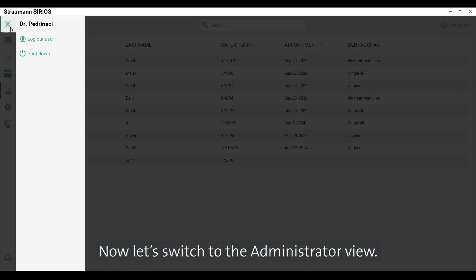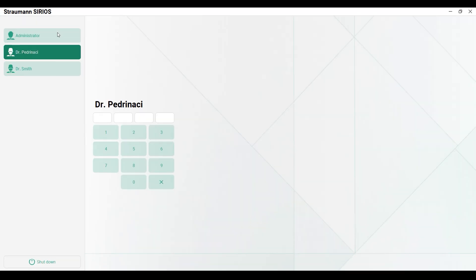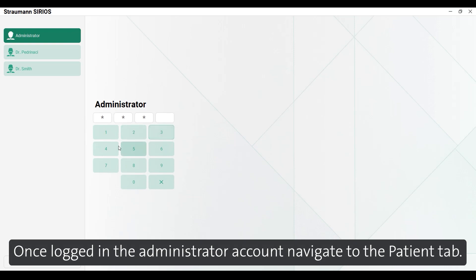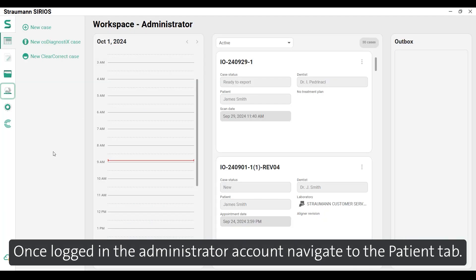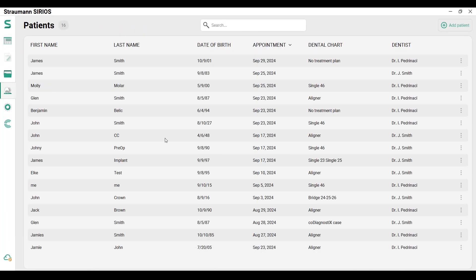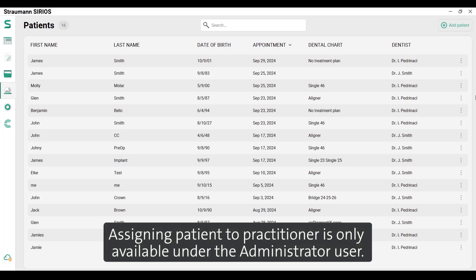Now let's switch to the administrator view. Once logged into the administrator account, navigate to the patient tab. Assigning a patient practitioner is only available under the administrator user.